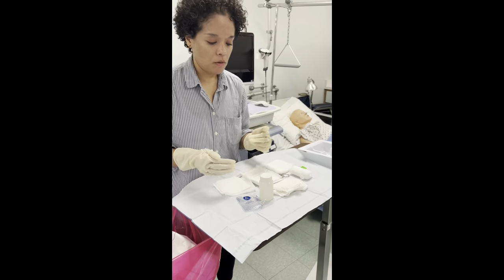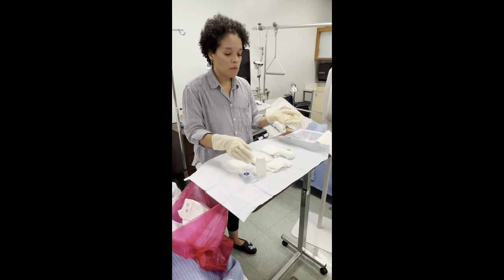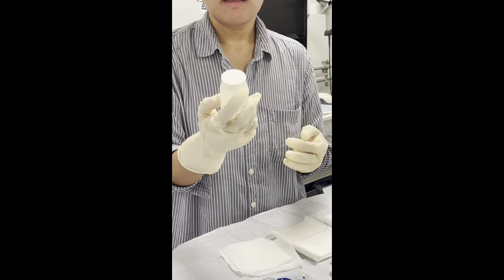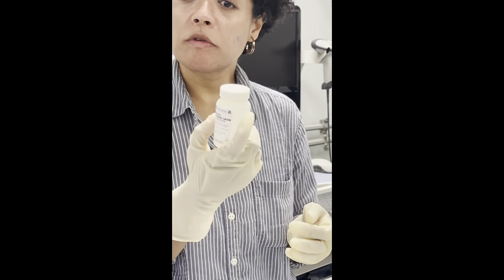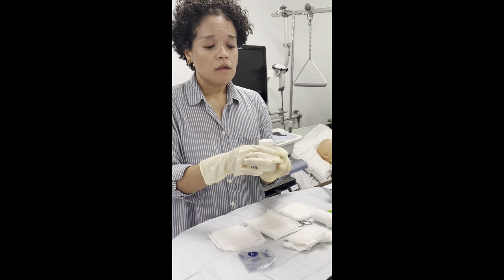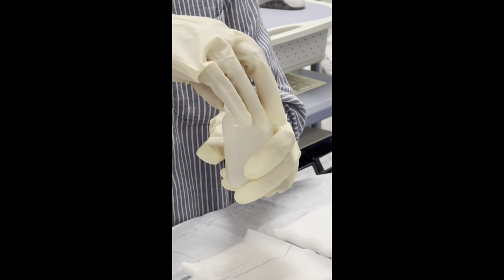Okay, so now we're going to pour the solution. So I have here the solution that we are going to be using. This was also mentioned in the physician's order that we would be using the normal saline, which is sodium chloride, 0.9%. Now be mindful as you are opening the solution. Is there anything else you should be observing?